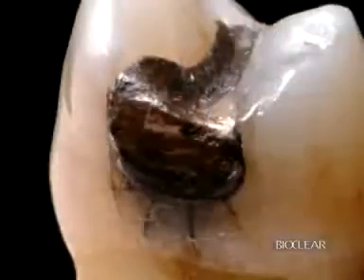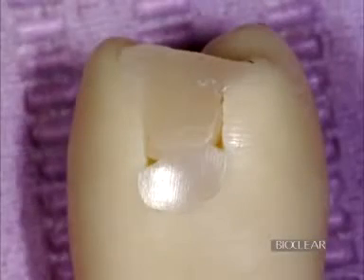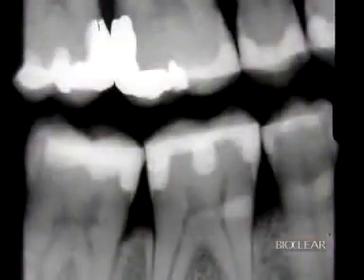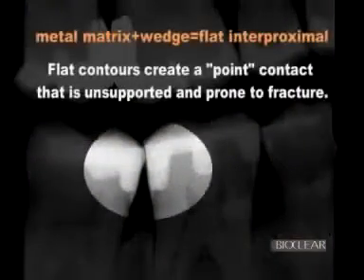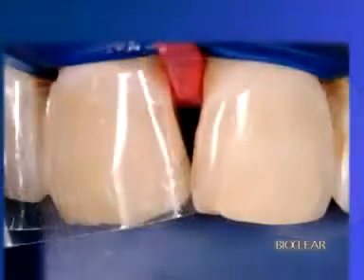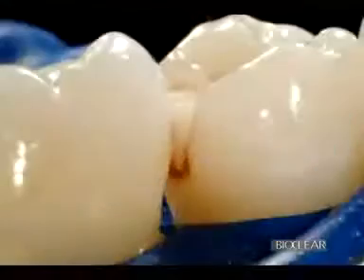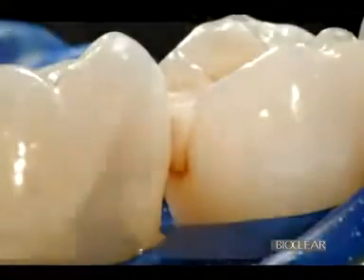We have multiple problems with the current system. Probably most importantly is the tooth fracturing from the current cavity preparations. We have another big problem. As we fill from gingival to occlusal, we have voids and seams in between each layer. We have a problem with poor contacts because the current matrix systems don't allow the composite to swell the way amalgam did. The wedges cause black triangles between the teeth. And finally, we have lots of problems with microleakage, especially at the margins.